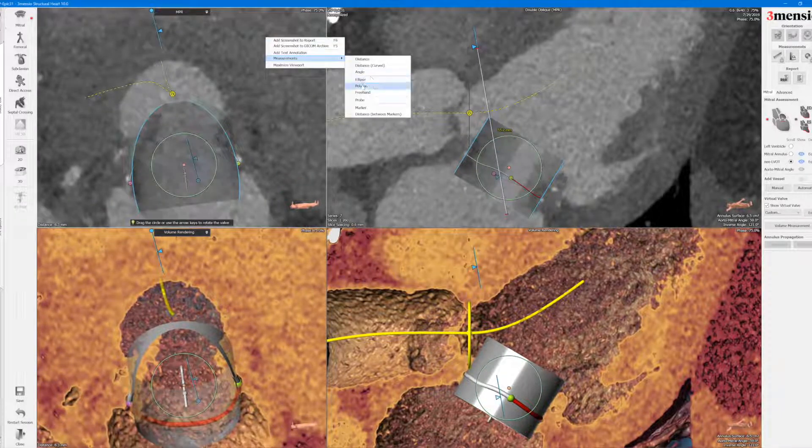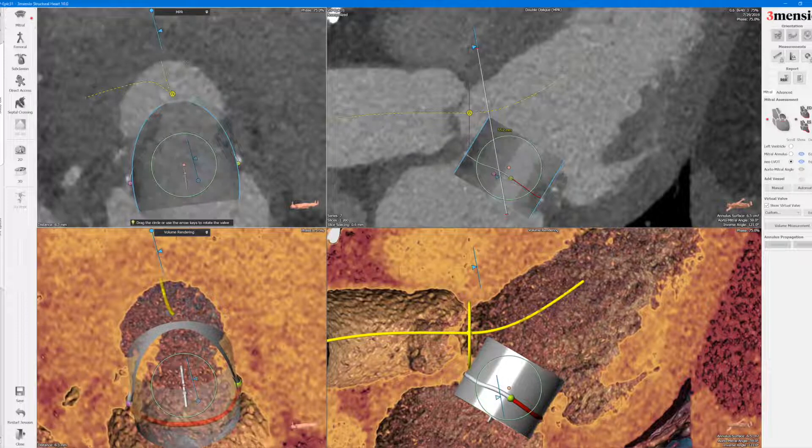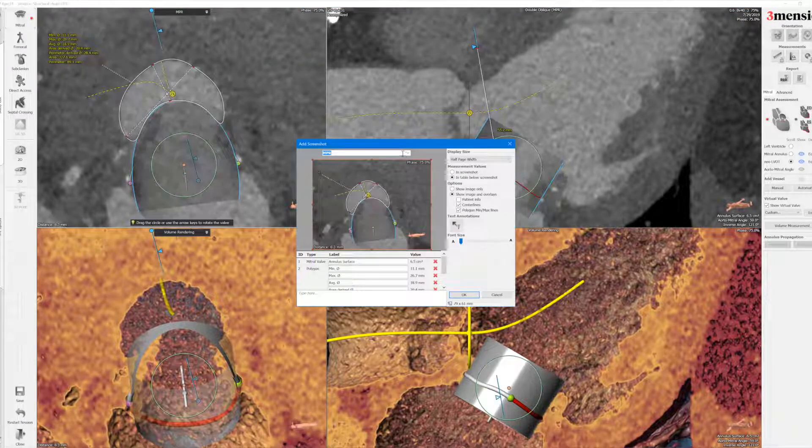And here's your new LVOT measurement. Right-click and then go to polygon. You trace out the area that's remaining after this balloon-expandable valve is occupied and has pinned the leaflets open. You can see that here — wide open new LVOT, no issue there.